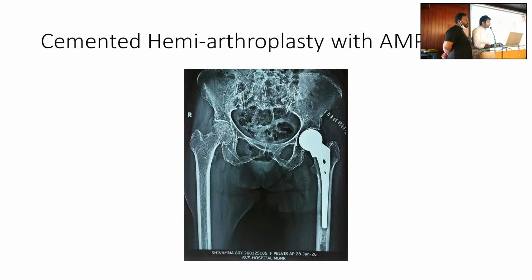That's why you chose only AMP. It did not fit well, sir. It was not going in. Unable to. That's why, no option available. What was the size you have put? 41, sir. It looks a little big. 41.